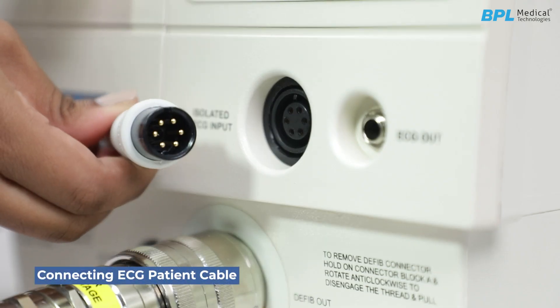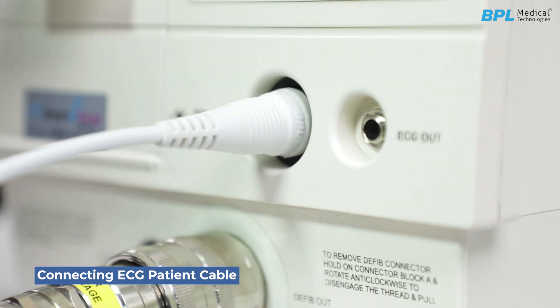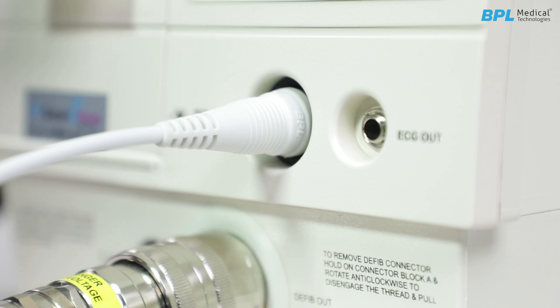Connecting the ECG patient cable. Connect the ECG patient cable plug to the ECG input connector on the front panel.